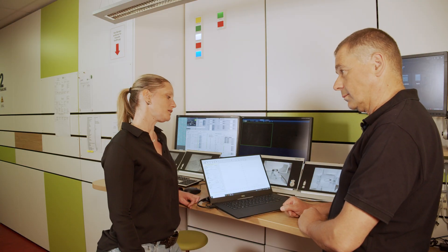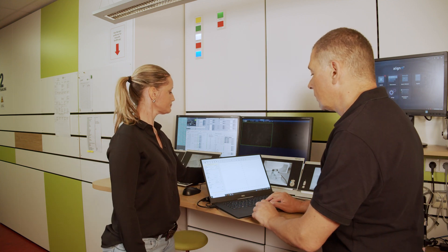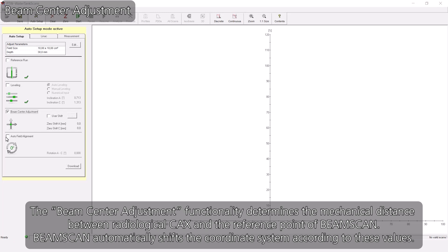To continue with the auto setup, you need to start the beam center adjustment and auto field alignment with beam on. Okay, let's start. The beam is on.